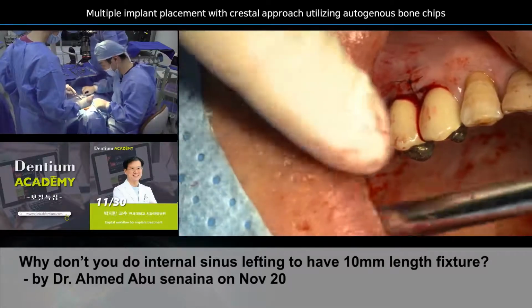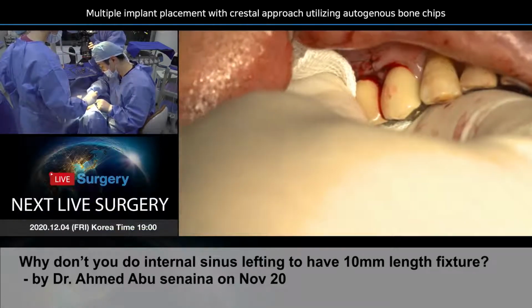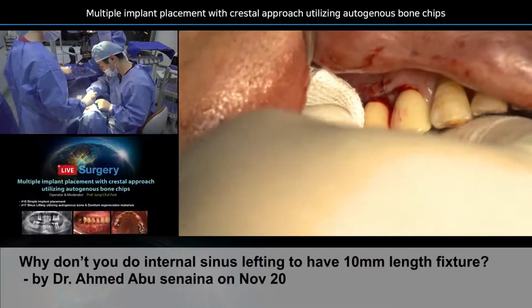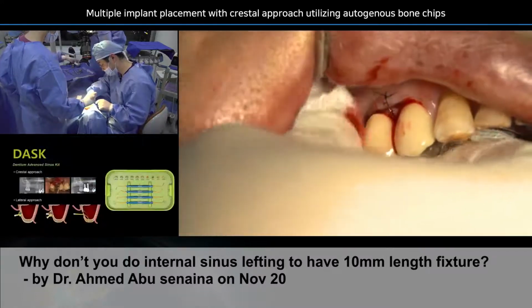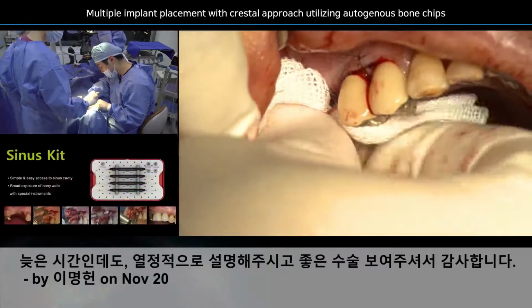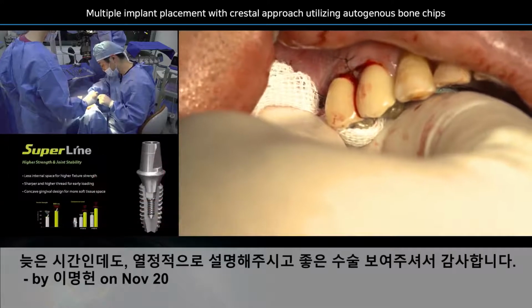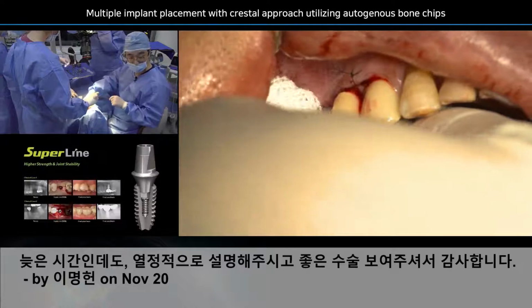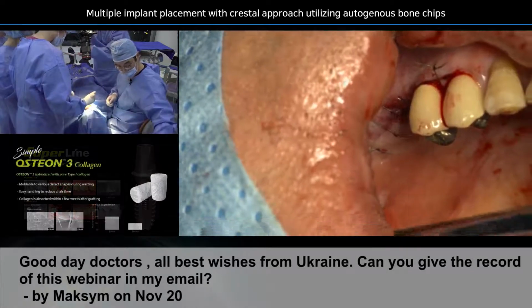So after the surgery, what I do is use manual pressure always because there will be some dead spaces and also some hematomas. So before you send the patient for the radiographic examination, always apply some pressure and properly do the bleeding control, and then apply the wet gauze packing, then the patient is ready for the radiographic examination.